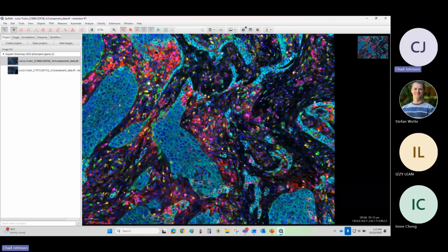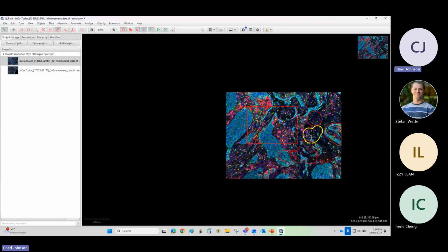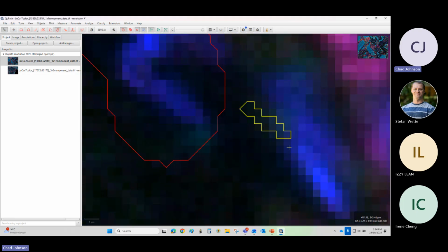This is the move button if you want to move things. You can draw boxes, you can draw circles. These ROIs are used to select specific parts of the image. You've got your polygon tool there. The paint tool can be quite handy for selecting large areas. The only thing is you have to color it in. Now, the size of that paint tool depends on the zoom. So if I zoom in really close, it gets very, very specific.